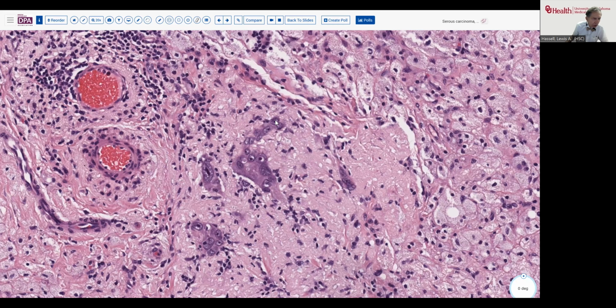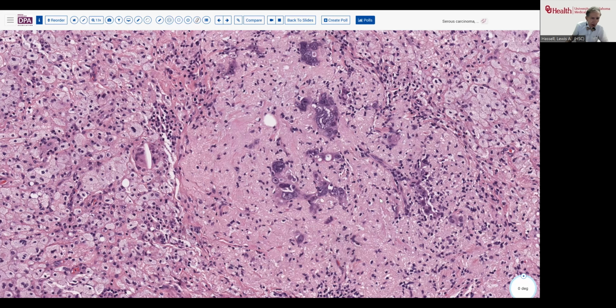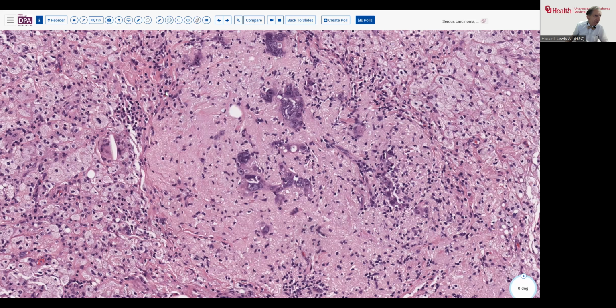In fact, even the nucleoli are almost the same size as some of those cells. Now, if you have doubt, you could do some marker stains potentially to verify that these were keratin positive cells. They may retain many of their inherent markers of neoplasia, but sometimes after chemotherapy, you can lose markers or they become paler, or there can be some other changes, and we'll just touch on those briefly later on. But this indeed was an area of residual tumor.